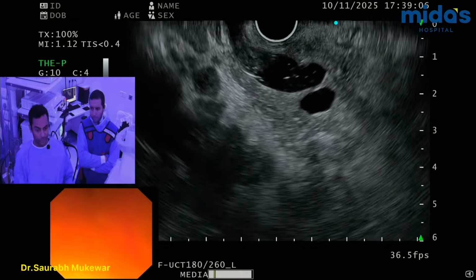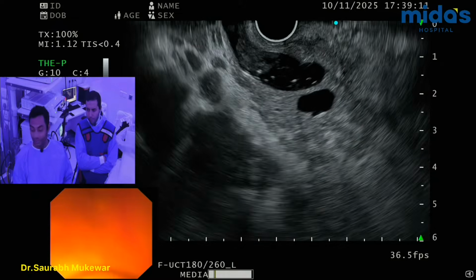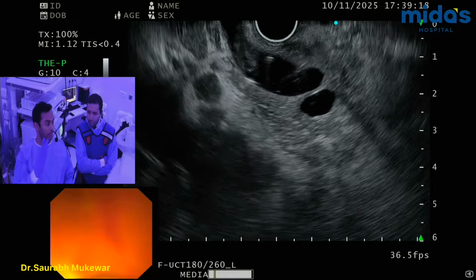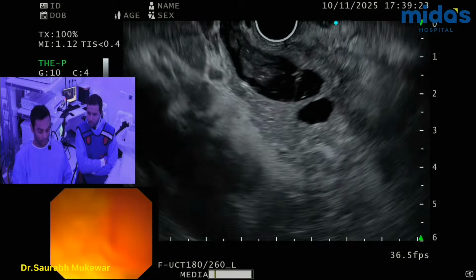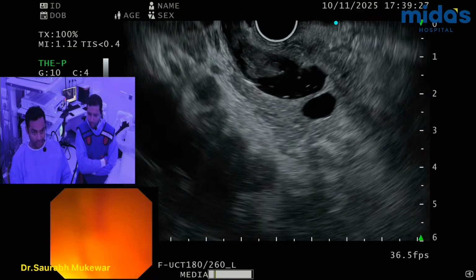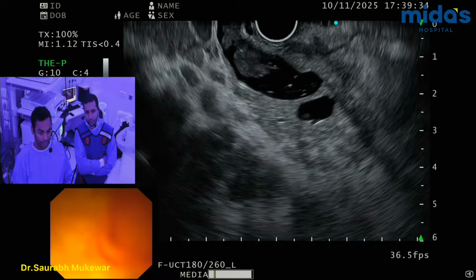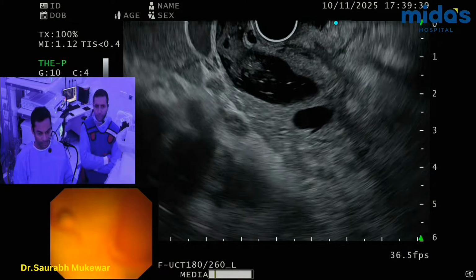Right. So that's why if I had to puncture up, where I told you, I would have hit a complete 90-degree angle. Yeah, which is not good. Then you cannot put a stent. So that's why I wanted to hit in this manner where I'm at least having a little bit of a runway to the duct. Now obviously it's never going to go all the way down till the left of the screen, but as long as the stent reaches till the bend, I'm okay, because I mean 2 centimeters, 2.5 centimeters inside, it should be fine.